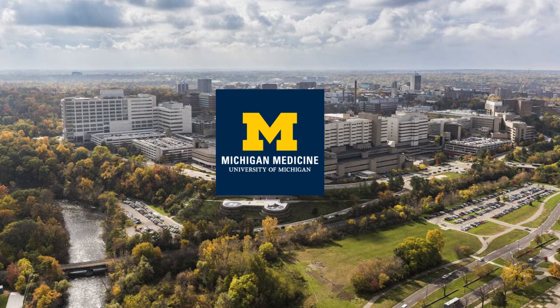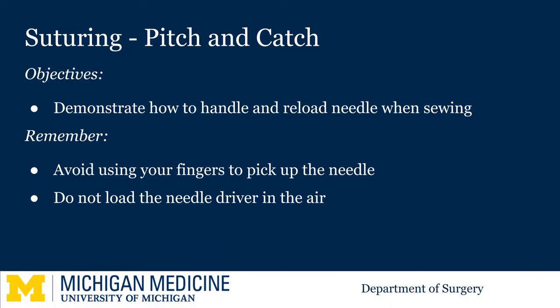Welcome to the University of Michigan Micro Learning Program for the Surgical Clerkship. Today we are covering the pitch and catch technique used when suturing. This is used for efficient sewing and helps avoid the common instinct to use your fingers to pick up the needle or load the needle driver in the air.